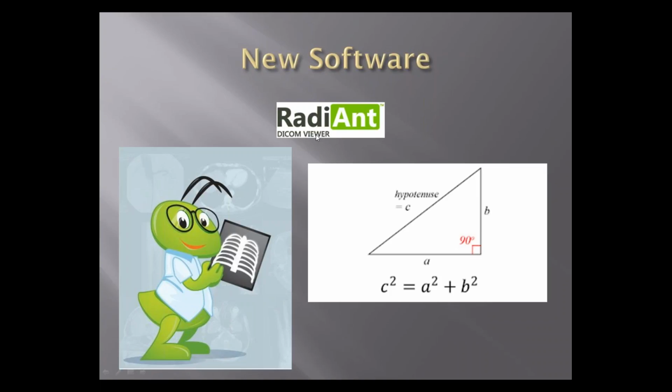All of your MRIs and your x-rays and things like that are DICOM images. And so those images are the ones that you're going to get on the discs if they come as a disc. If it comes as a straight film, you're going to have to remember your geometry, which is why I put this up here.